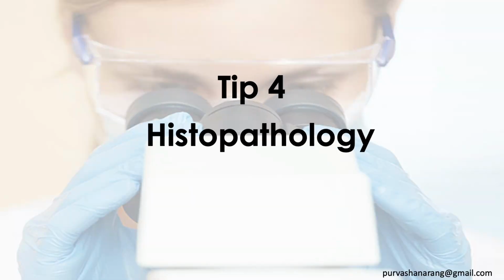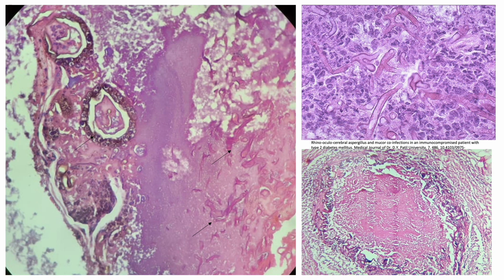On histopathology, one may determine the presence as well as invasiveness of the fungus. The specimen is sent in 10% formalin solution. Usually, hematoxylin and eosin stain this fungus well as against aspergillus. Apart from the typical hyphae morphology seen under direct microscopy, one can observe vascular invasion, thrombus formation, granulomatous reactions, tissue infarction, and necrosis too.